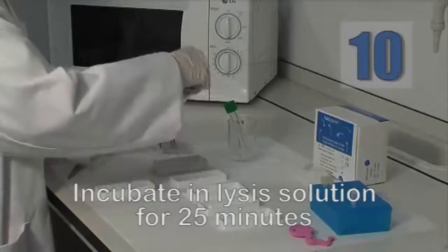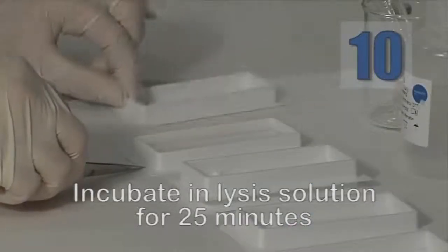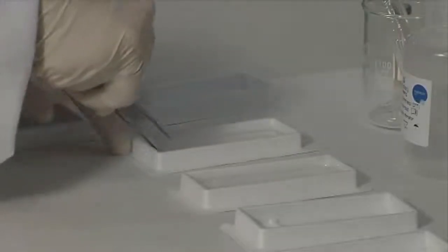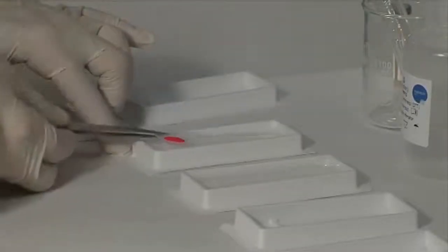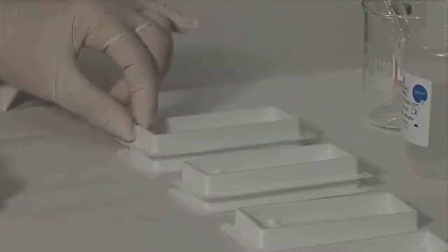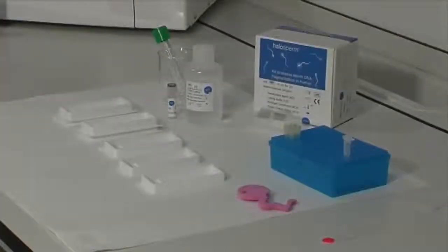Remove the slide from the AD solution using forceps and place it in lysis solution for 25 minutes. The lysis solution removes most of the nuclear proteins, giving rise to the chromatin dispersion halos that determine the amount of fragmentation that the DNA has incurred.